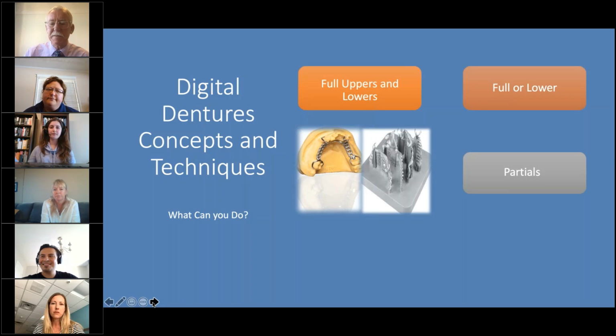And as you said, Esther, cash flow. Getting cash in is king. If you can turn around your chrome frames faster, whereas, I don't know what it's like in Canada or Australia or Ireland, in New Zealand sometimes in busy times it can take a month to get your chrome frames back. Laser sintering is fantastic. And I think there's a webinar in itself about chrome partials, designing and how to manufacture them.